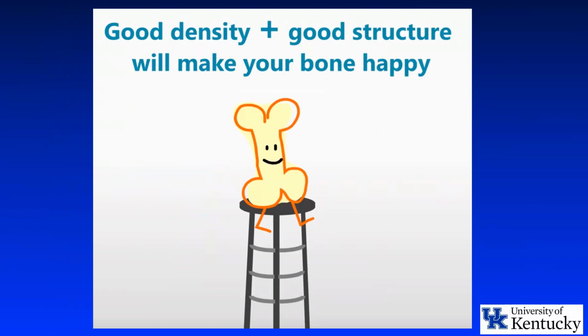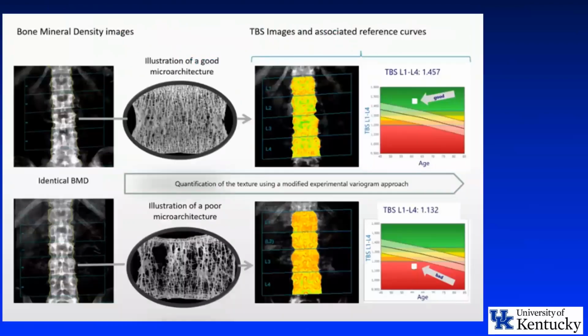And you have to have a good structure, microstructure, nanostructure, microarchitecture, better, good bone quality. How can we evaluate bone quality? It's a big topic, but briefly, there is a software. When you ask for a DEXA scan, don't only focus on BMD, ask for TBS, trabecular bone score.